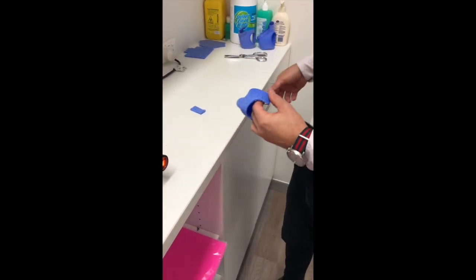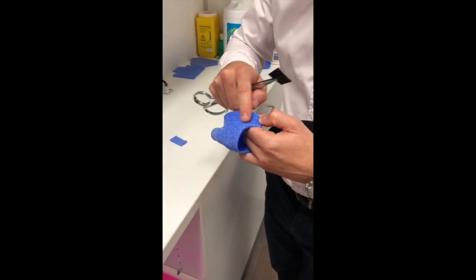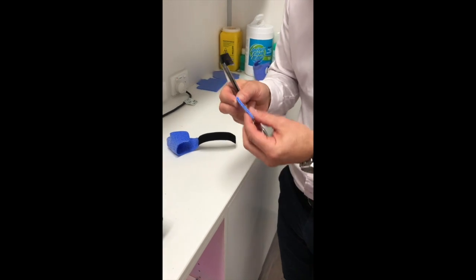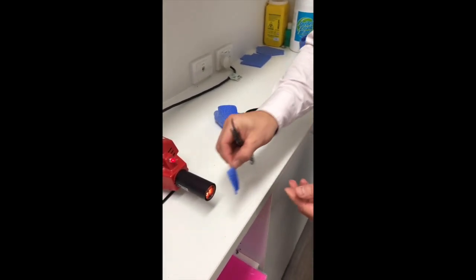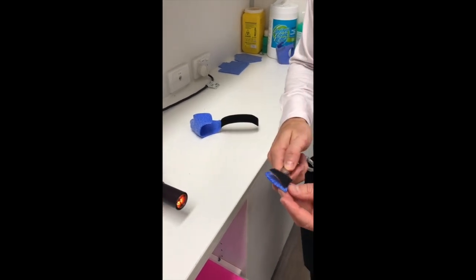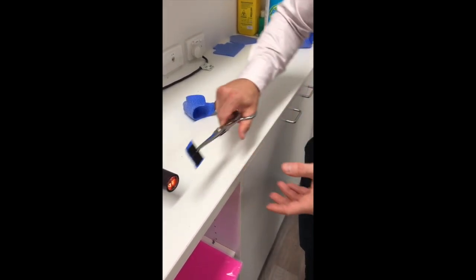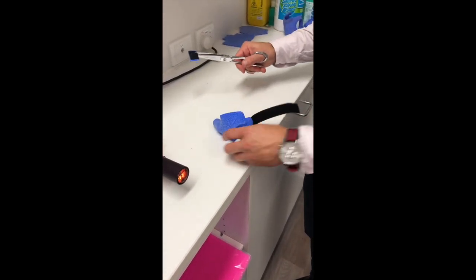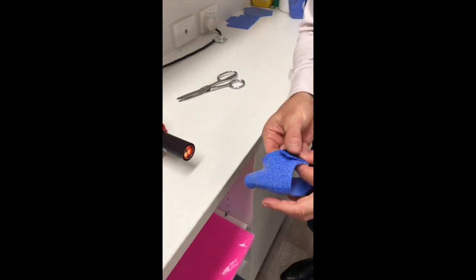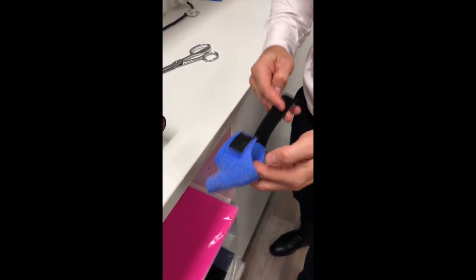Securing the hook is slightly different though. Most adhesive velcro hook won't attach to this product while it's wet. What we simply do is get a dry piece of our Orficast, heat that with dry heat to make it just slightly shiny, and also heat the adhesive of our velcro hook, then join them together — that will be an absolute permanent bond. The next step is to secure our dry heated Orficast to our wet Orficast, which bonds absolutely perfectly. Press those together quite firmly and we have a permanent bond.